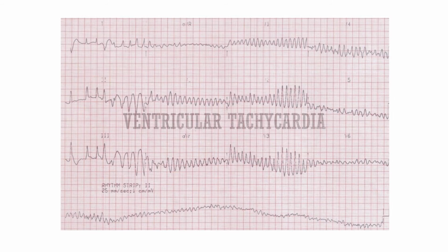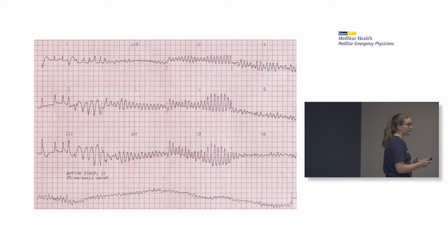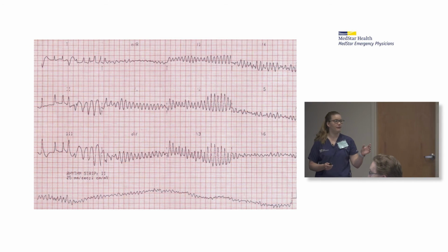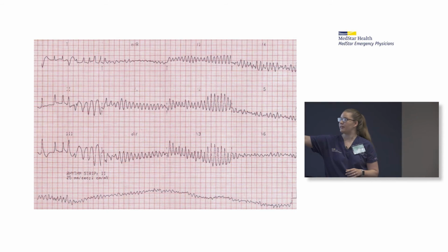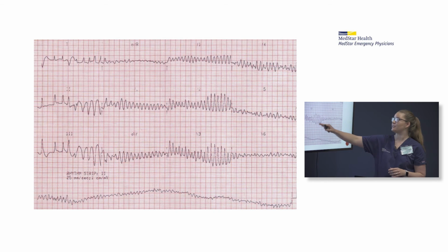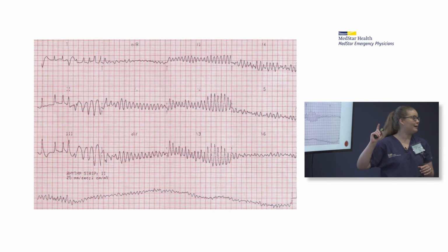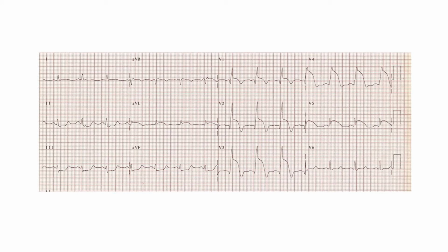All right, close. Look at this bottom one, which gives you the clearest picture, because this is a bit of a confusing EKG. It's that fine, coarse, very irregular rhythm that's going to be your ventricular fibrillation. I agree with you. I think here this looks like torsades, but the reason that's happening is because these are all different leads, showing you different amplitudes in each lead. Moving on.